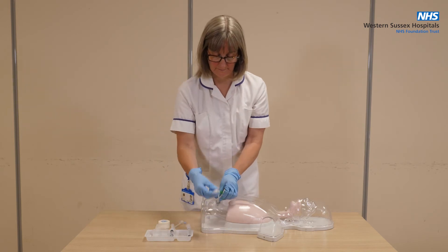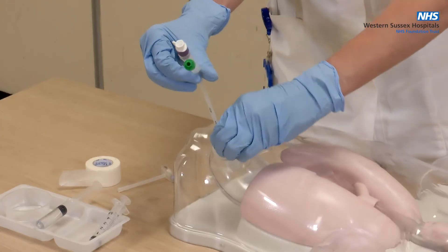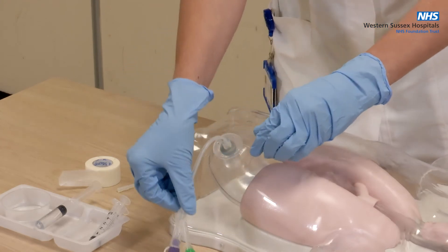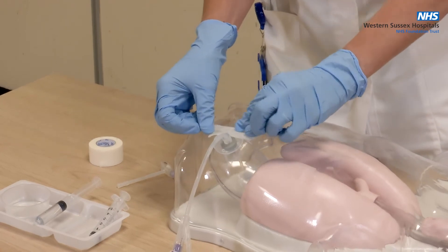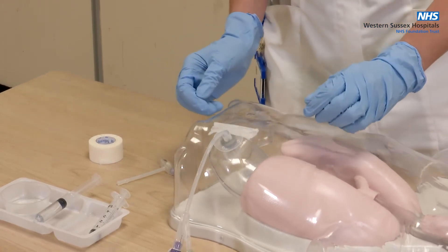Now, rotate the tube 360 degrees. Then, tape the tube to the skin using micropore tape. This is to avoid accidental removal of the tube.